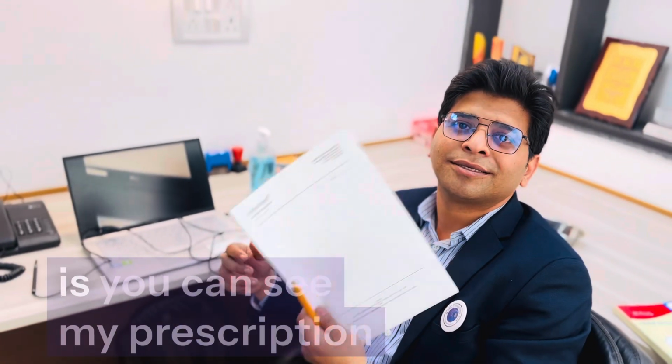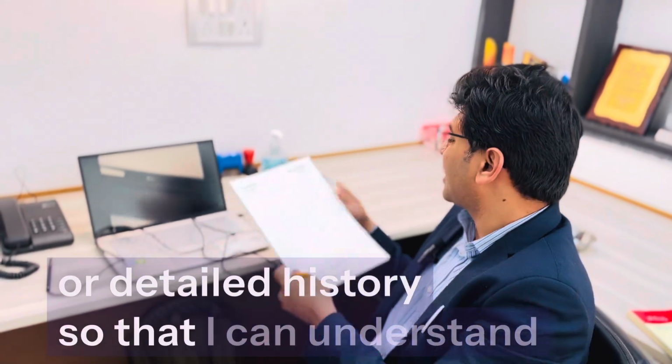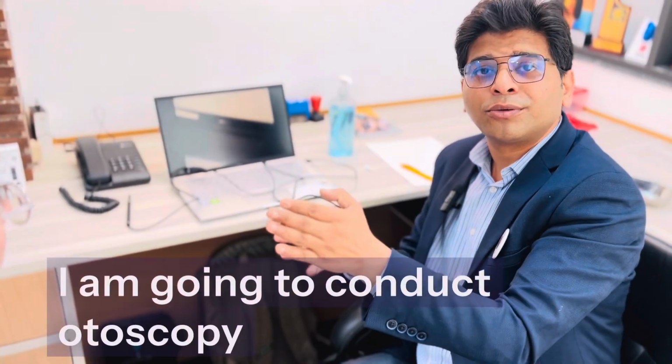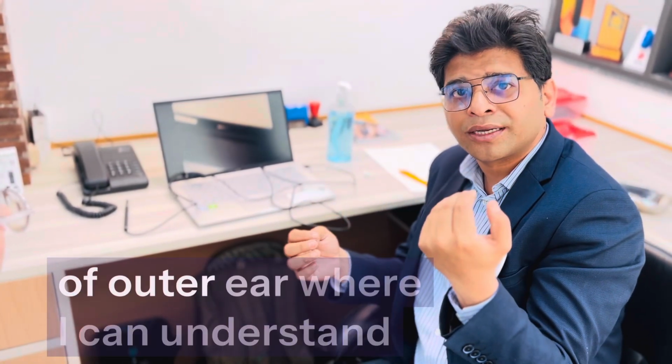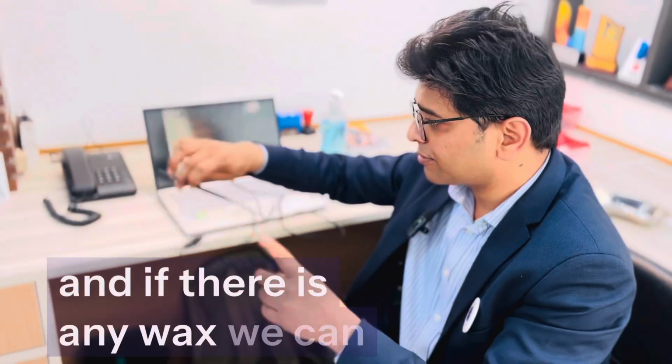First thing is, you can see my prescription pad, so I'll be taking a brief or detailed history so that I can understand about the hearing loss, the nature of hearing loss. I'm going to conduct otoscopy. Otoscopy is the examination of the outer ear, where I can understand if there is any presence of wax, and if there is any wax, we can get it managed.